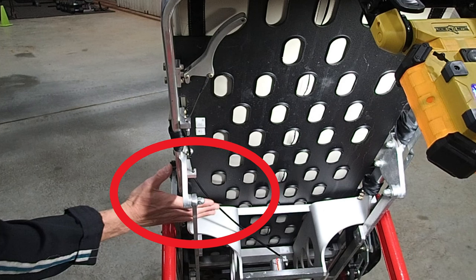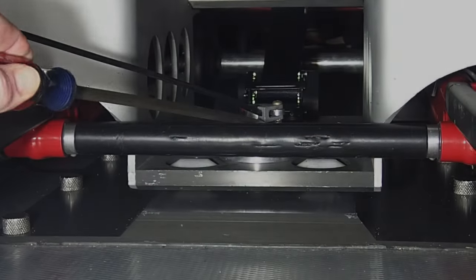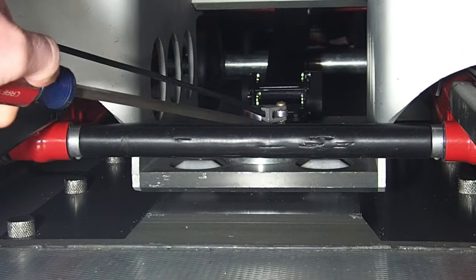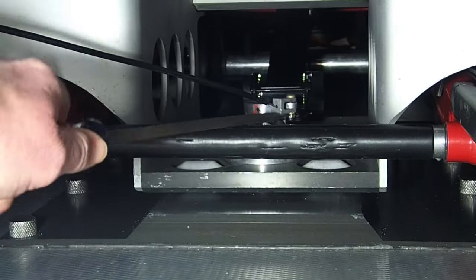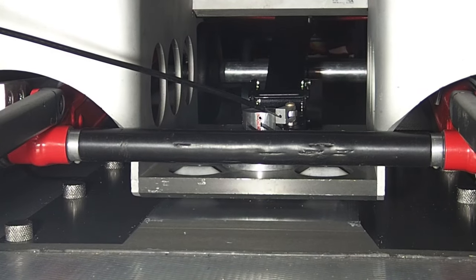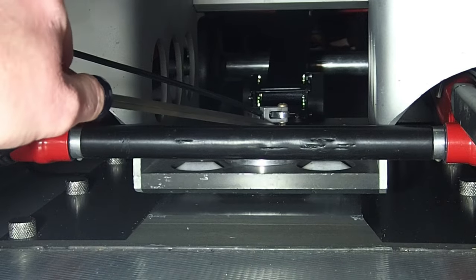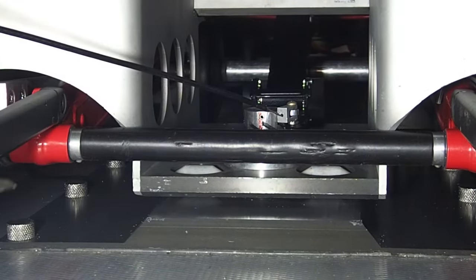That's pretty much all the information the crew needs to know — the rest is for maintenance. If your helicopter jumps the cam, which is rare, you need to get a long screwdriver. You can get leverage on that bar with your screwdriver and pry it up and rotate it so that the red lines line back up again.